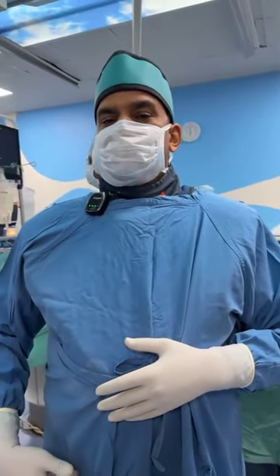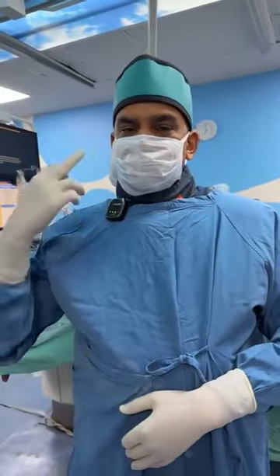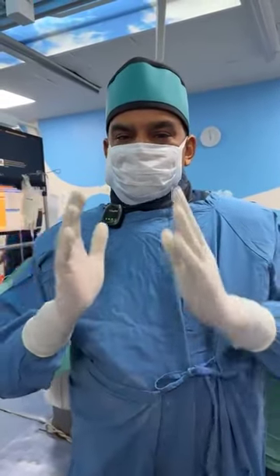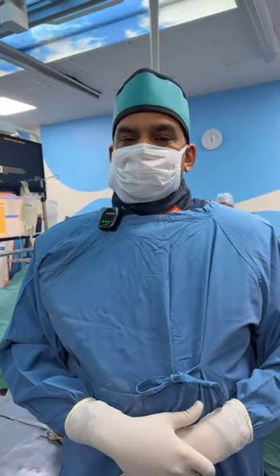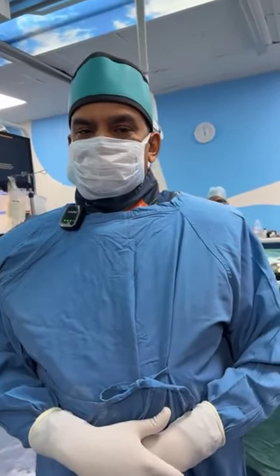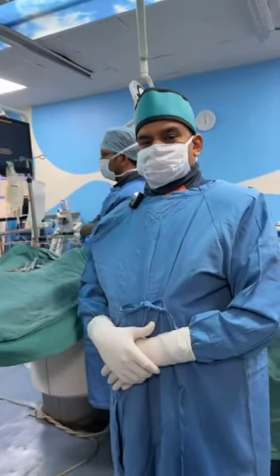from the groin we are going today. We can also go from the radial artery in the hand. We'll go to the neck and do an angioplasty, put a stent, and improve the caliber of the blood vessel, hence preventing recurrent TIA or stroke. So let us see how we do this procedure today live.